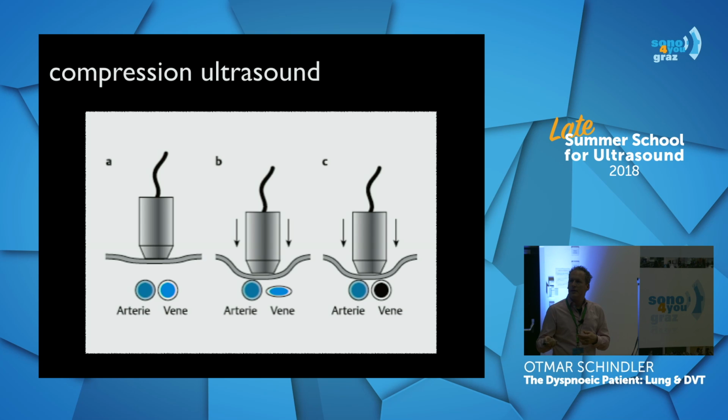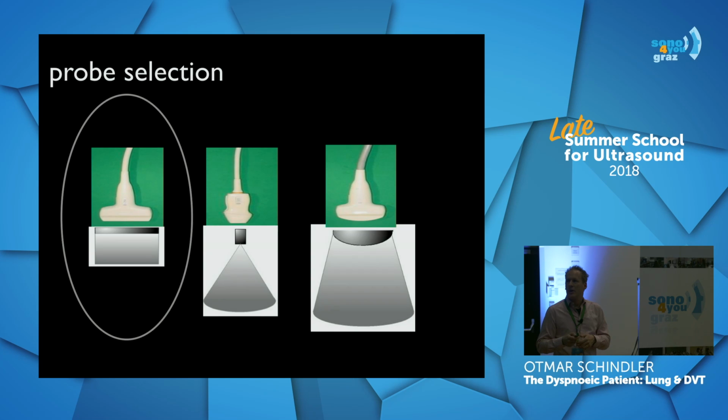The second thing is that if you see some structures inside the vein, what will it be? Most people don't stick anything inside the vein, so if there is something in the vein, it will mostly be a thrombus. So that's the 2 things you can see. The one thing is here, the vein is collapsible, there's no thrombosis. If it's not collapsible and something is inside, that's highly suggestive of thrombosis.